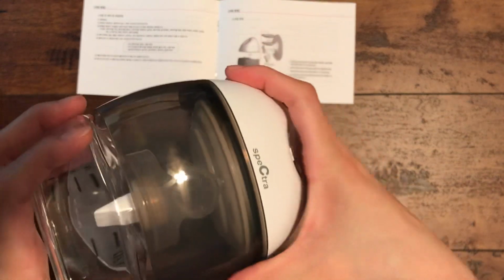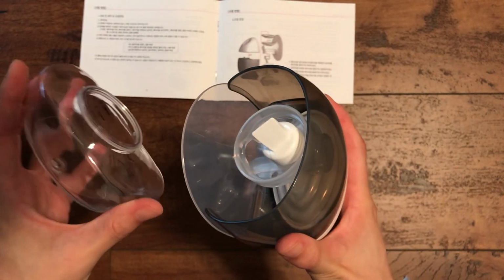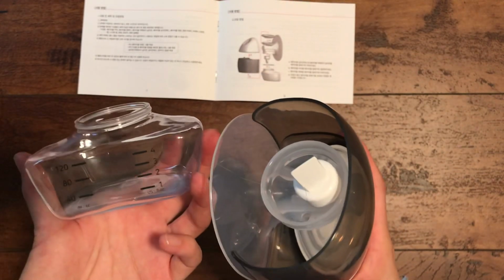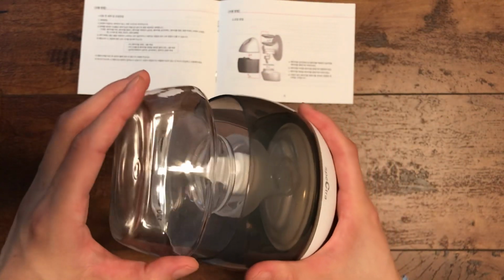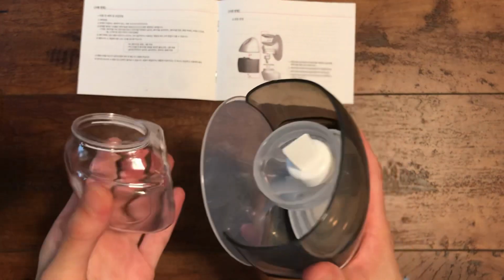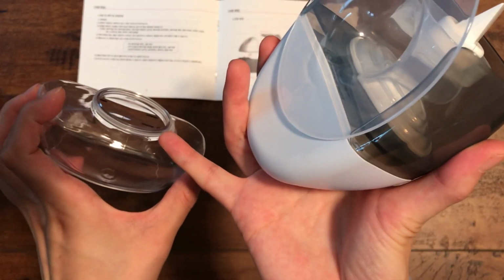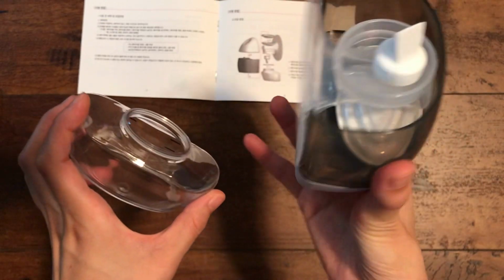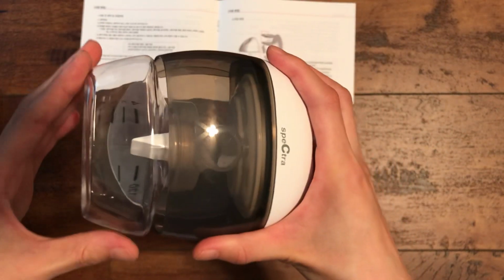So what I found to be one of the flaws, or one of the downsides of this pump, is that I don't really feel like this bottle is very secure when I push it in, because all the way it's being held is by a thin silicone ring around it, and that's what's holding these together.